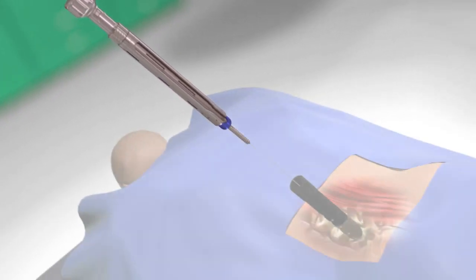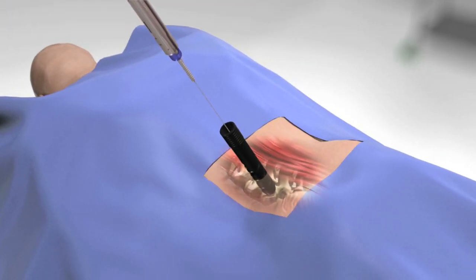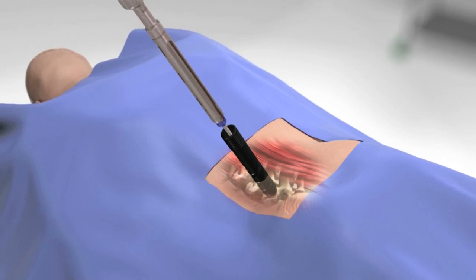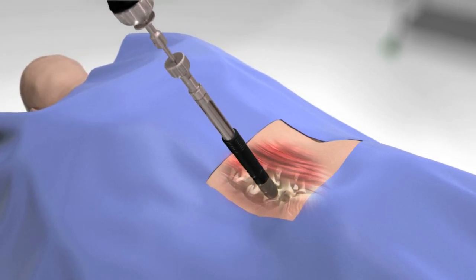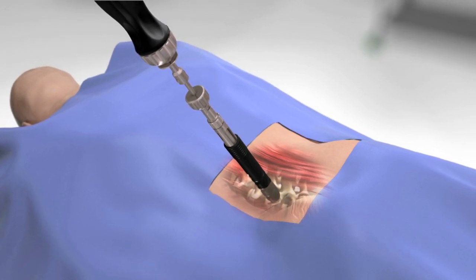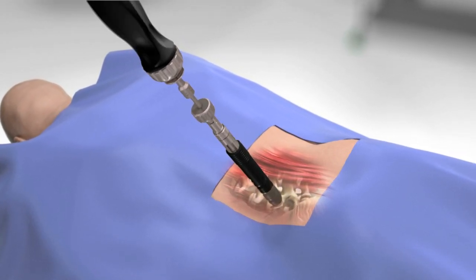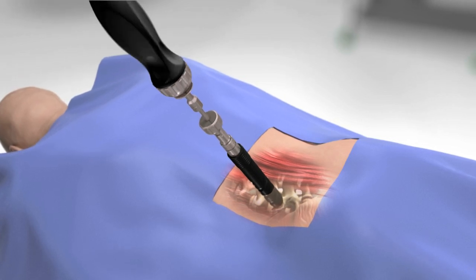Carefully direct the driver, screw and screw extension assembly over the guide wire. Continue to advance the assembly until the screw is docked on the pedicle. Once docked, the pedicle screw is then advanced to the desired depth.